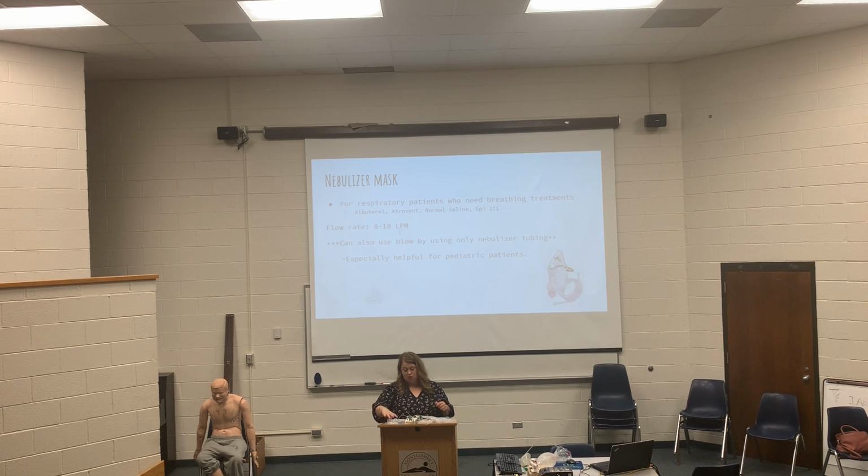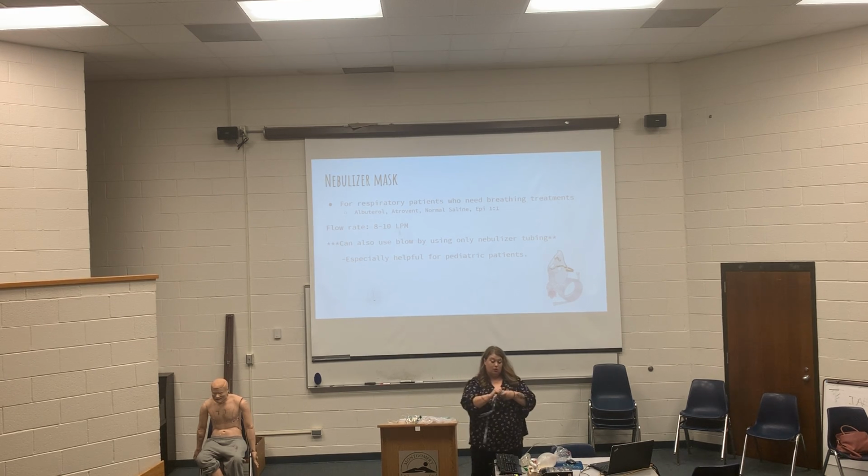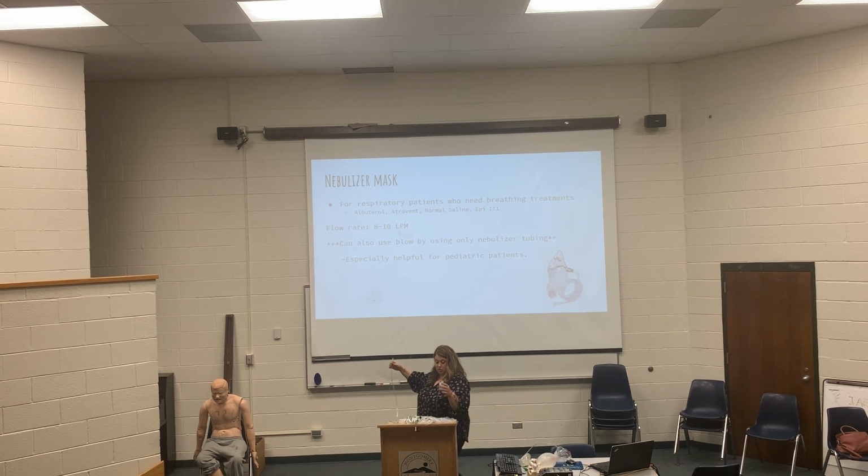So you pull out the package, you open it. This is the medicine reservoir. It opens like this. So you will get the albuterol, open the albuterol. It comes in like a little squeeze packet. You'll squeeze that in there. And then you will hook up something to remind you of how it works is, see the blue in here? And this is the blue end. You always stick the blue with the blue. And this part will hook to the oxygen tree or the oxygen tank.